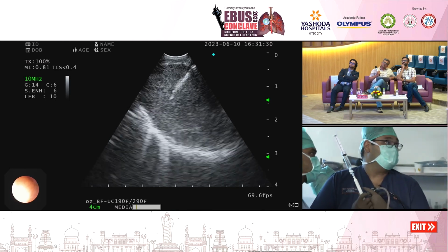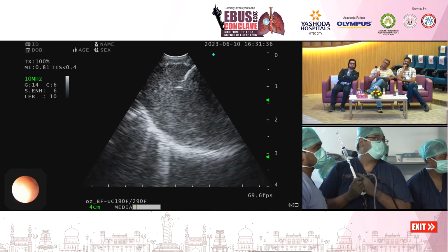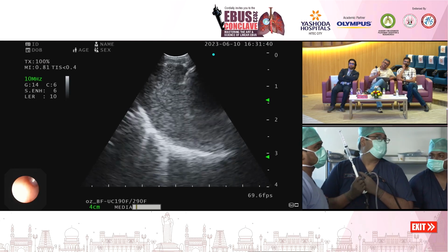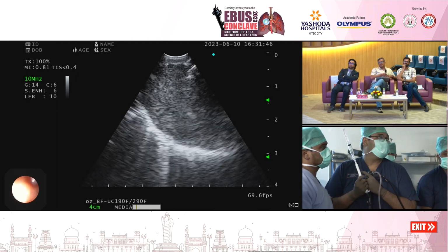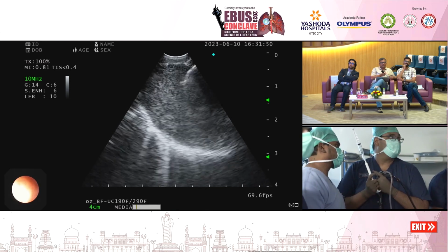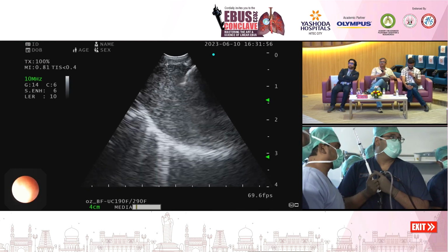If the tip is blurred, you might sometimes go beyond the node and not know where the tip is. If we see the tip clearly, the safety of the procedure increases. That is the only benefit of LER. It makes the peri-needle area more clear. That's all.